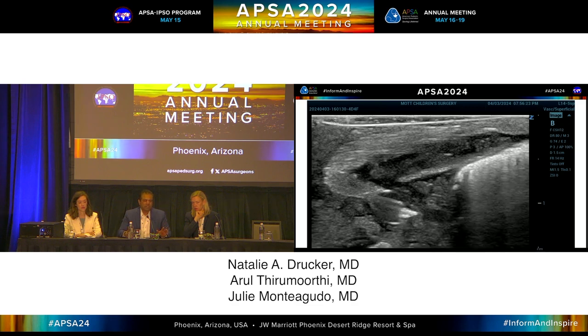We're just above the IJ subclavian junction. You can see the tip of the needle. You can see how it's actually through and almost to the other side. At this point, I'm going to advance the needle deeper in, and actually almost down to the level of the RA in these kids before I put the wire through, because that's the only way I know I'll get enough purchase.